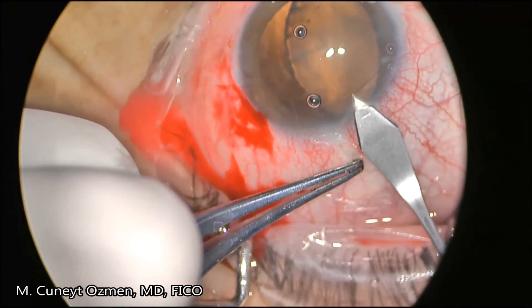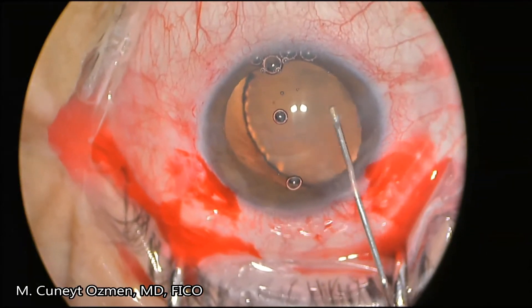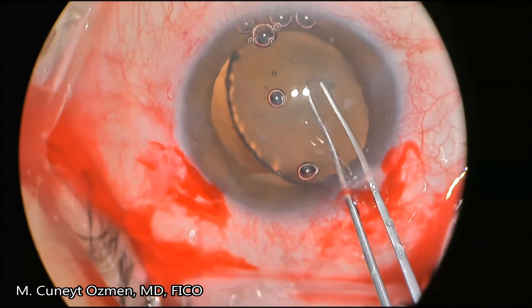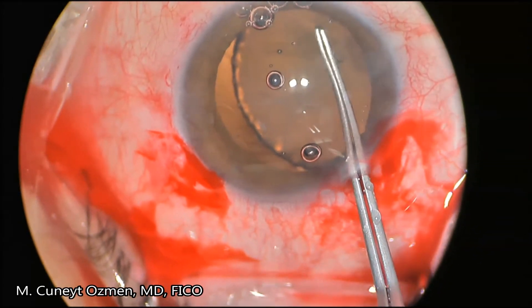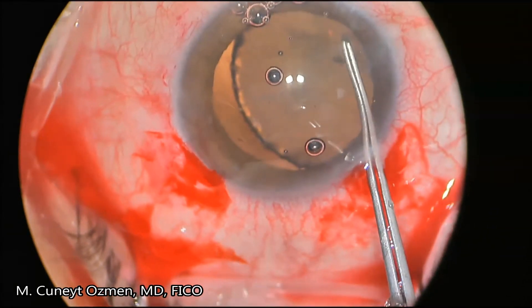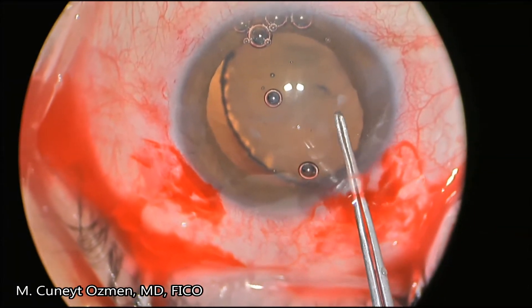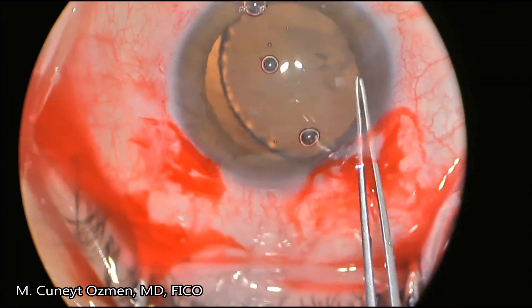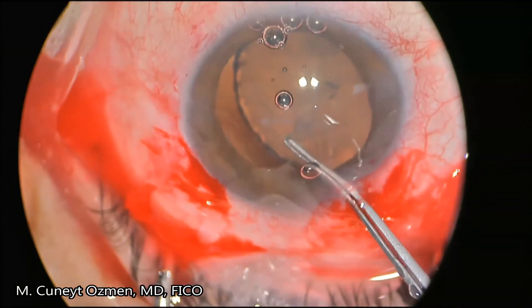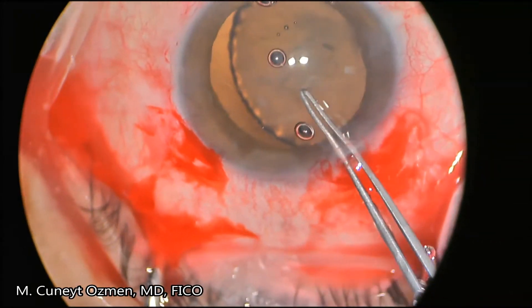Even after entering the anterior chamber with a 2.8-millimeter knife, we are able to penetrate the anterior capsule with a cystotome and finish the continuous curvilinear capsulorrhexis with an Utrata forceps. During these maneuvers, we did not need any additional procedures such as handling the anterior capsule with another forceps or supporting the anterior capsule with an iris hook or a capsular hook.